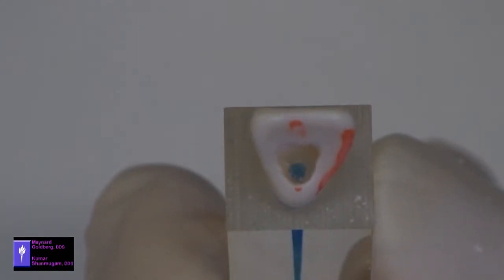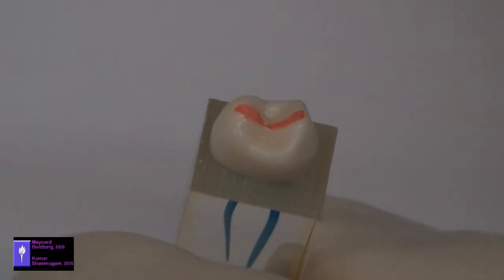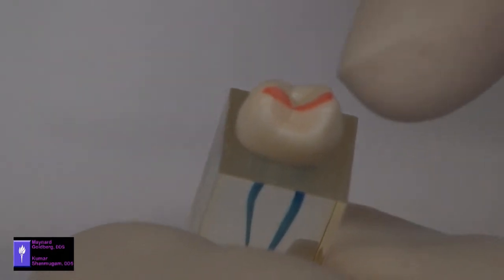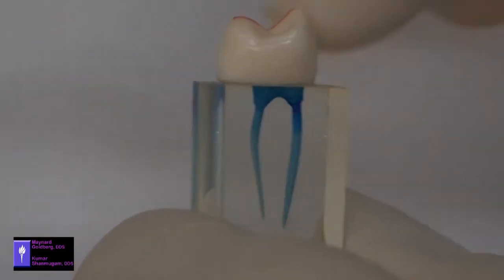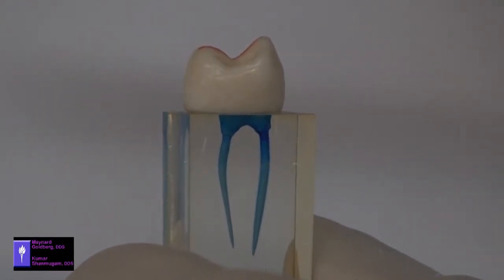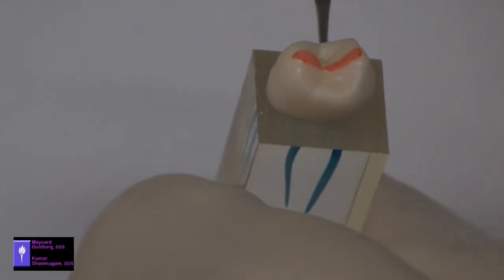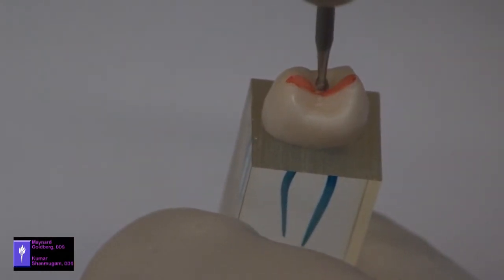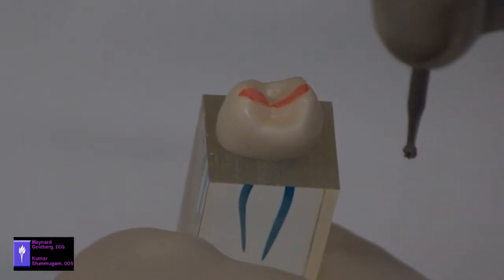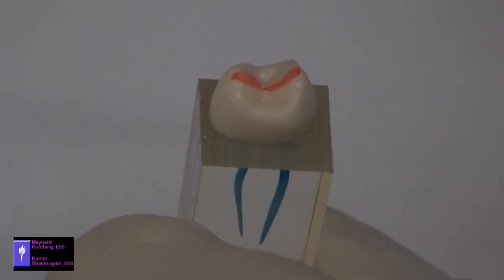We will now proceed to the maxillary premolar. Maxillary premolar and all posterior teeth. The long axis of the tooth is in a vertical plane. So the burr is placed in the central fossa, which is the junction of all the cuspal inclines, which would be at this point here. You then penetrate through the roof of the chamber and then funnel back, as we will demonstrate now.